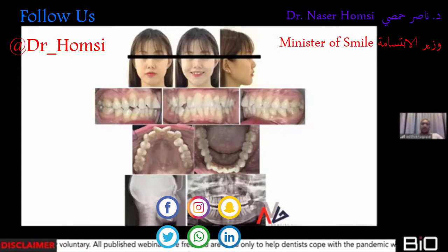You see the heavy amount of crowding that this case had. Most of you had already seen this. Definitely an extraction case, but this particular case did not want extraction. She did not want any kind of screws or any extractions, any third molar extractions, nothing. So I had to go in for a lot of IPR in this particular case. And this was the time when probably Damon brackets were on the hype, and I just gave it a go. I thought I'll just use them.